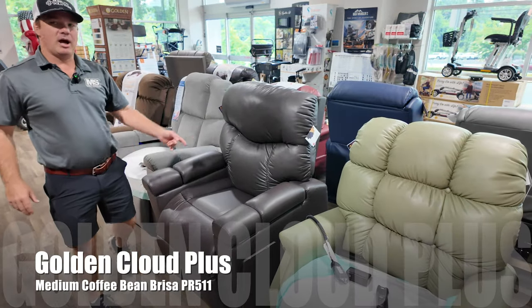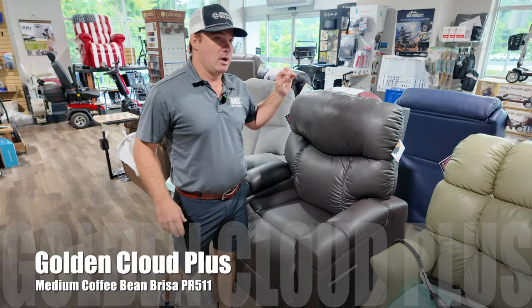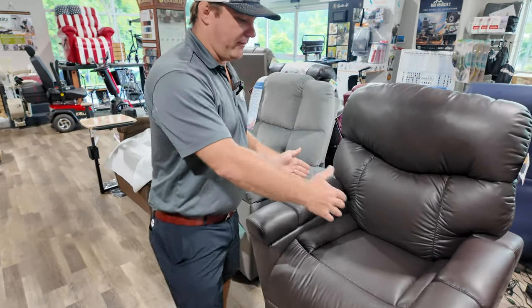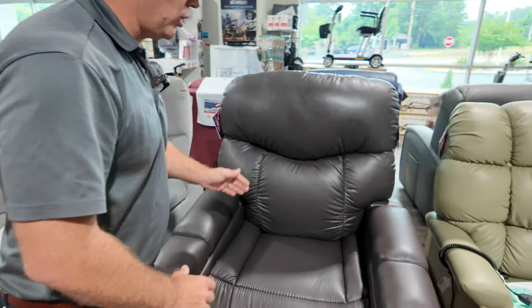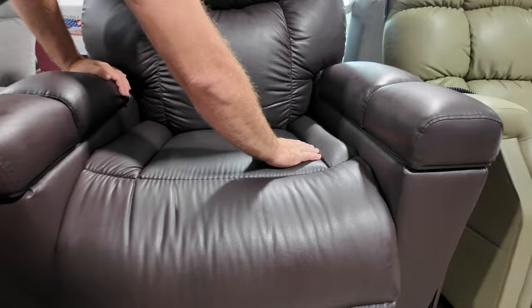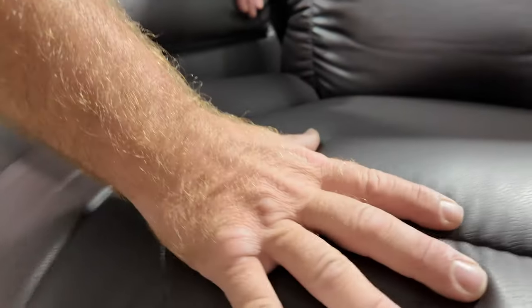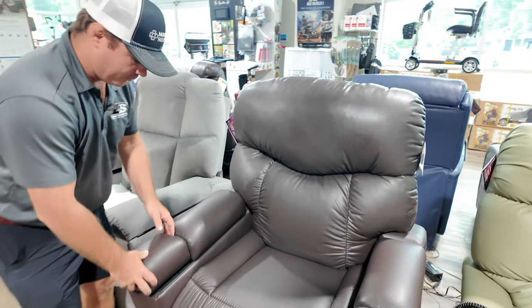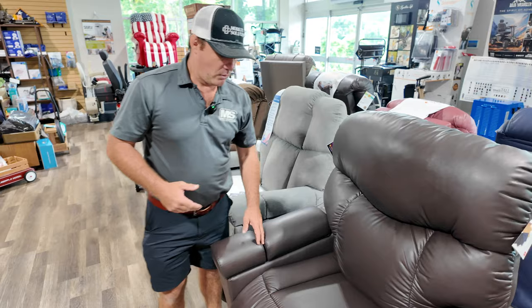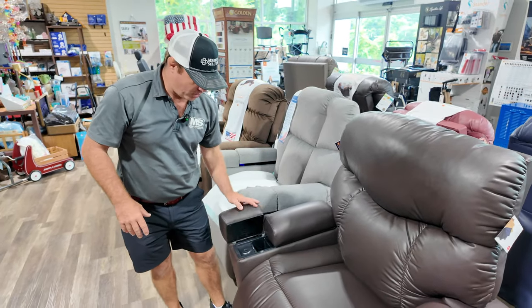Power Plus by Golden. This comes in three sizes: small, medium, and large. The large will be 25 inches between the arms. What's cool about this chair is this seat they have in it — probably their most comfortable seating. It helps with posture and it's just really comfortable. This is in Coffee Bean Breeza. So if you're going to be in a chair all day long or you have stuff all over the place, this thing has compartments.